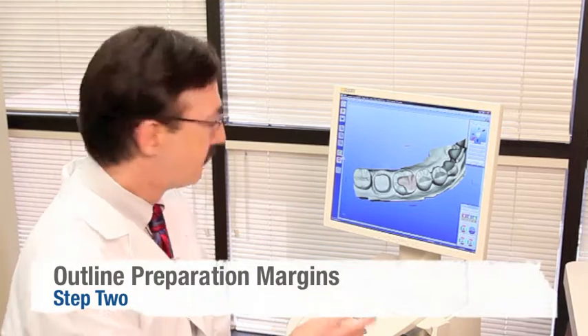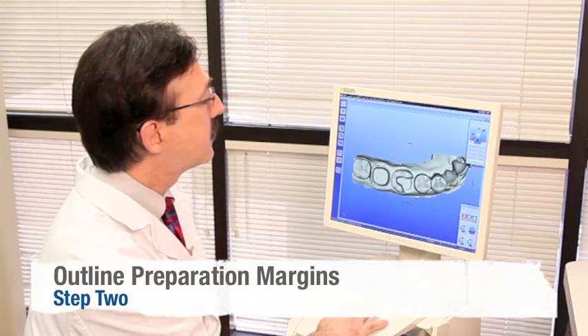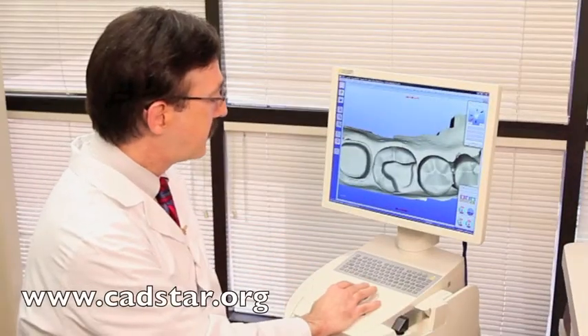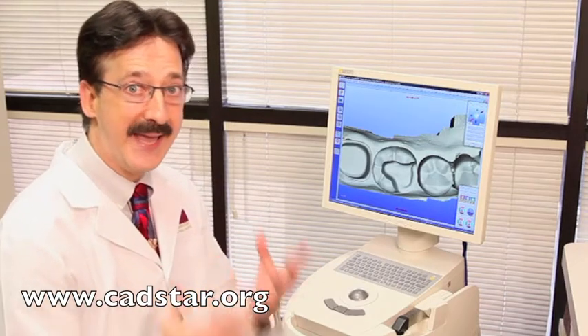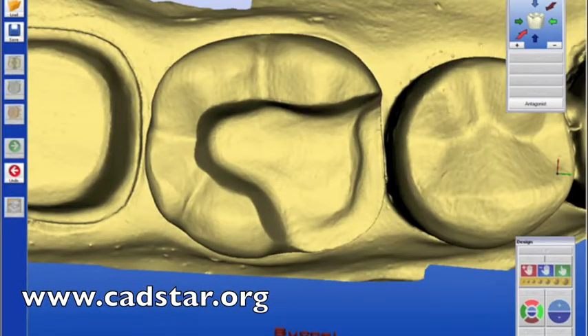Step number two is to prepare the margins — we'll hit the next button. This is where we're going to trace our margins. We need to find a very clean margin, and that's why it's important to have a clean preparation. I finish my preparations with a red finishing diamond. When it's precise, the computer will see that and give you excellent closed margins. We double-click the left mouse and notice how the computer will find the margin for you. I'm tacking it down with one left mouse click, then double-clicking back on my red dot — and I'm ready for tooth design.